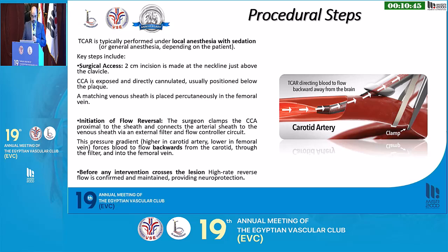The surgical access is a 2 centimeter incision made at the neck line just above the clavicle. The common carotid is exposed and directly cannulated, usually positioned below the plaque. The matching venous sheath is placed percutaneously in the femoral vein.